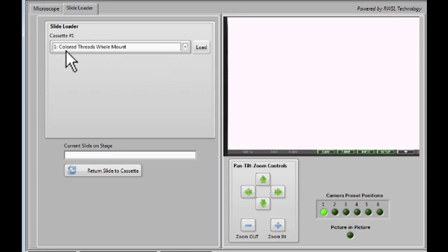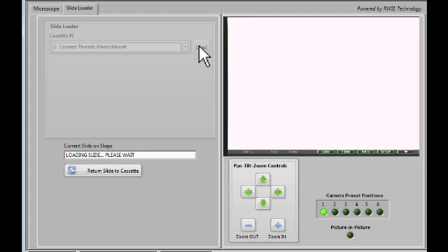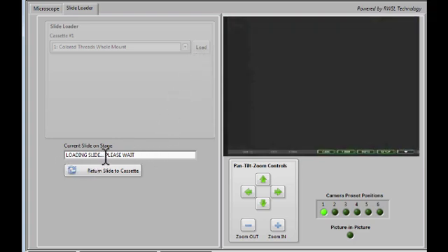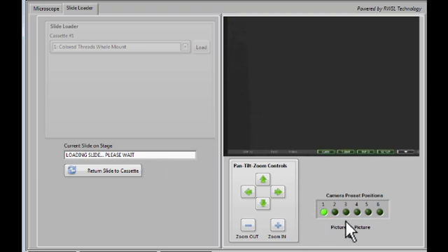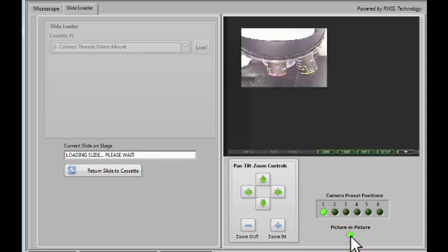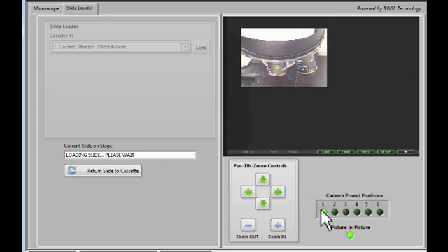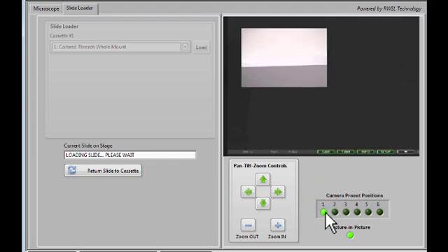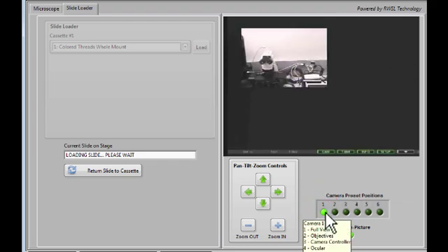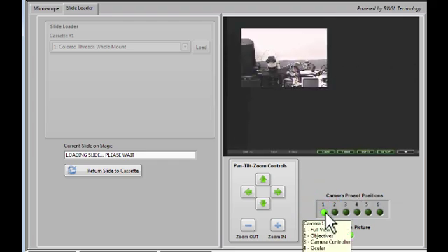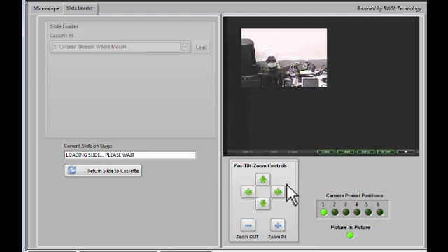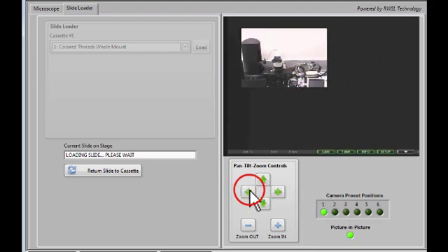I've selected a slide that I wish to load, and then I click the Load button. You'll see a message here saying that the machine is loading a slide, and you can also watch this if you click the Picture in Picture button and click Preset 1. You can watch the Slide Loader robot do its thing.